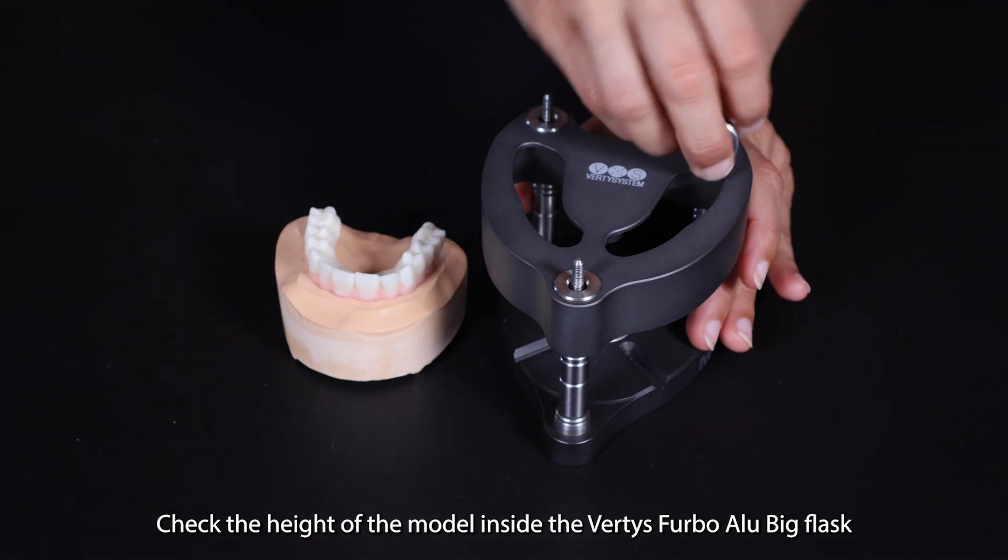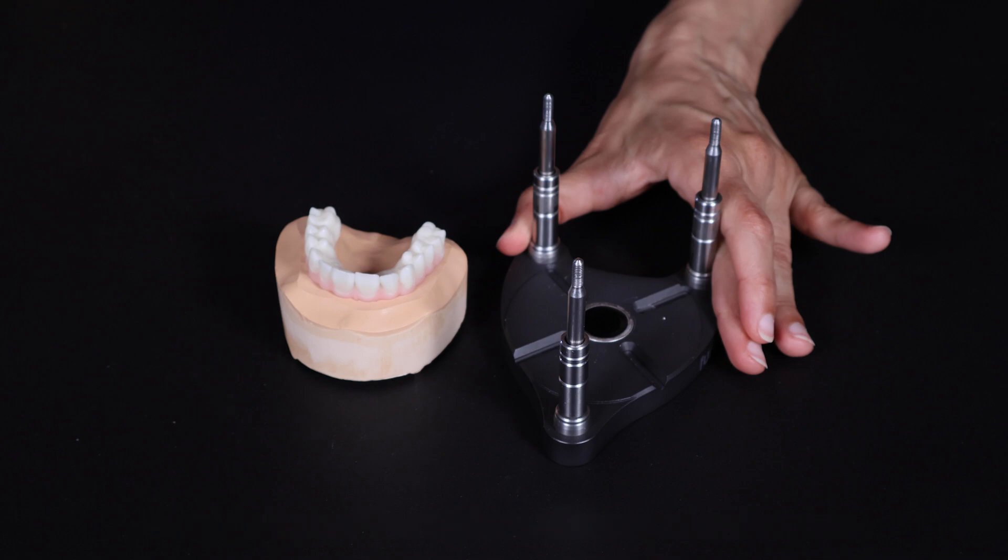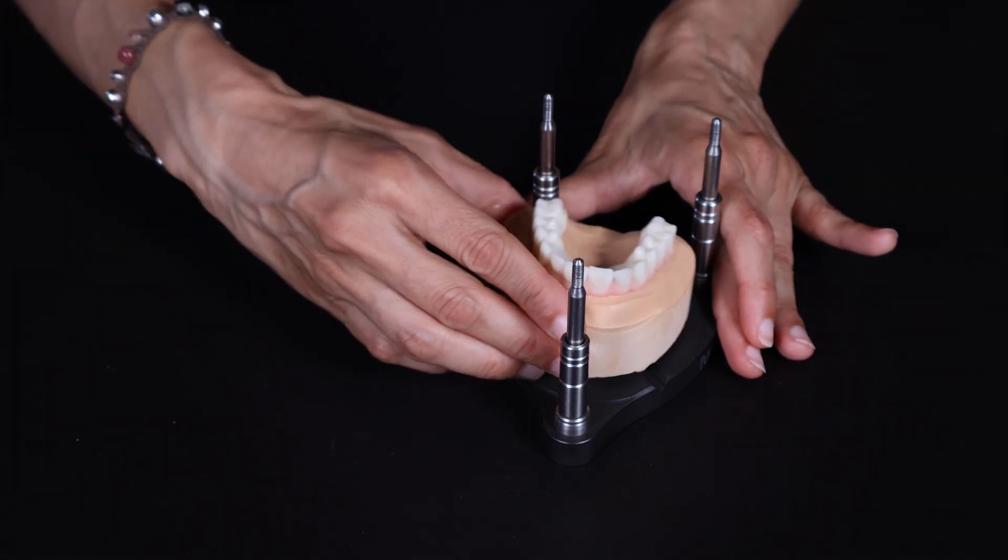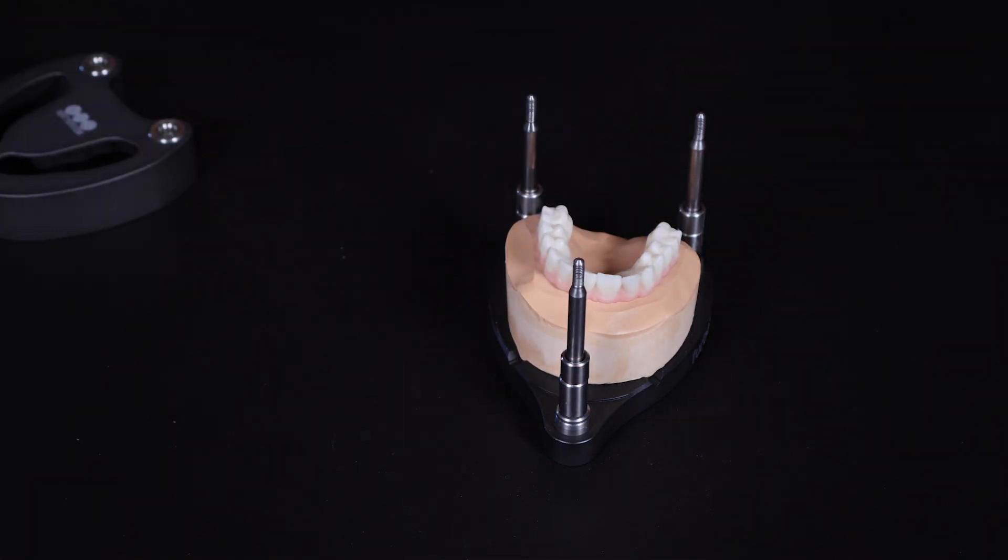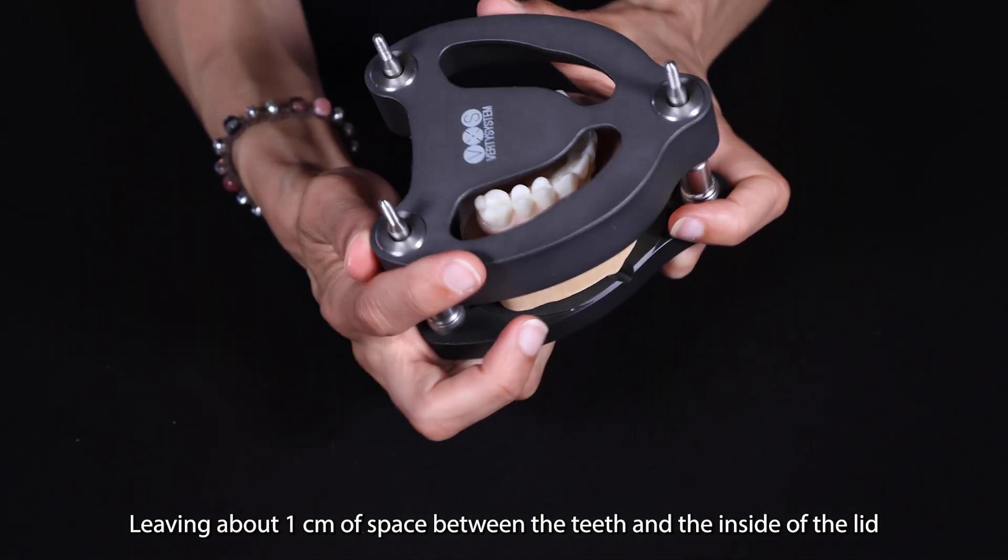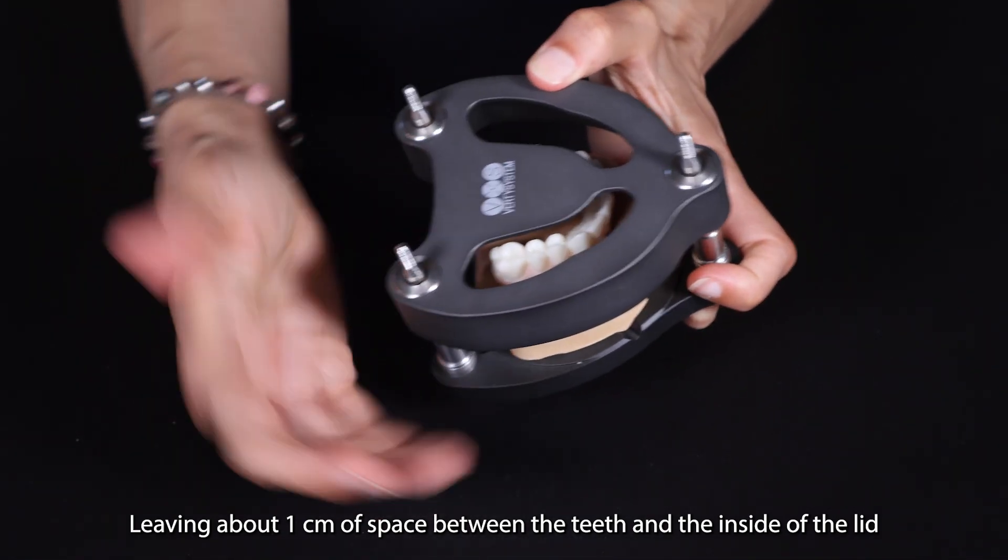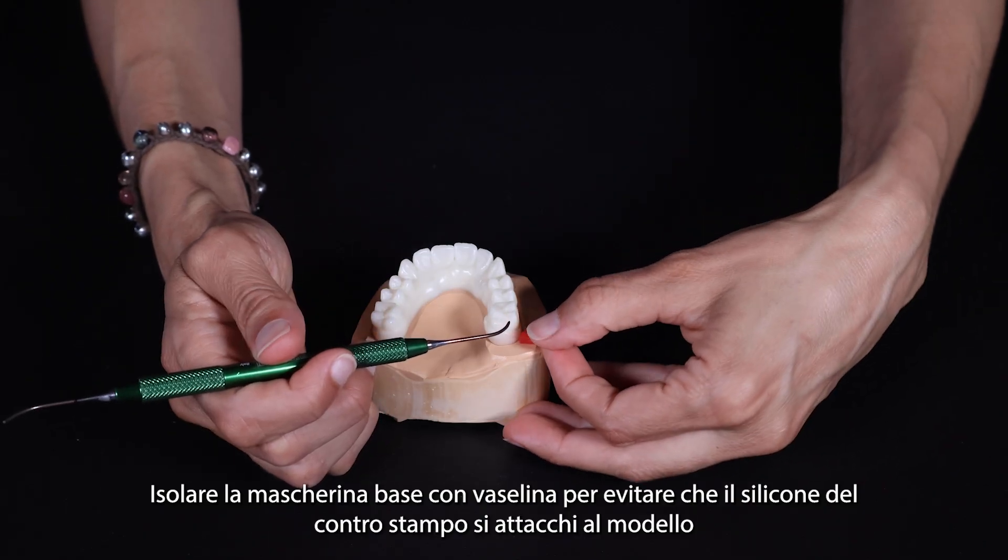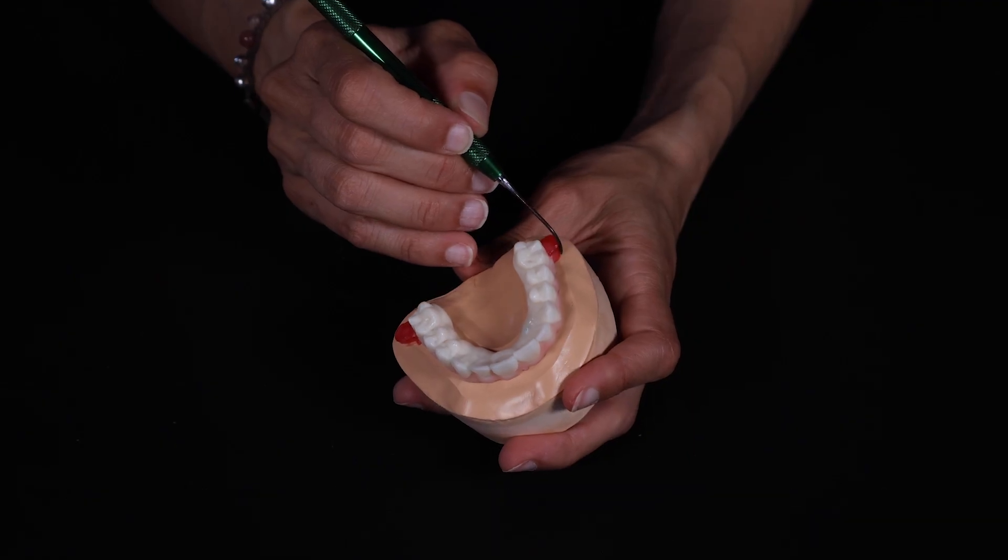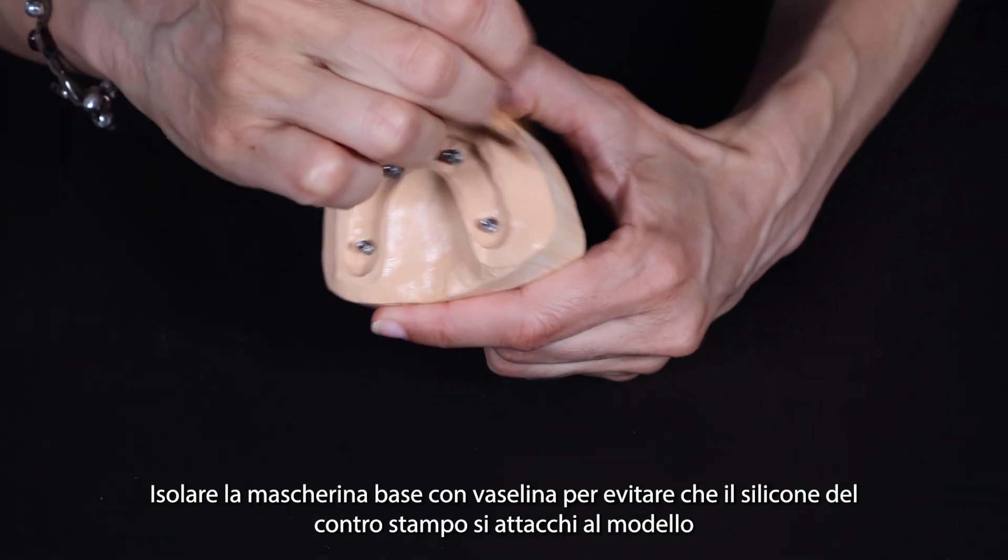Check the height of the model inside the Vertys Furbo Alu Big Flask, leaving about one centimeter of space between the teeth and the inside of the lid. Apply two wax peninsulas at the level of the last molars on the buccal side. Isolate the base mask with petroleum jelly.